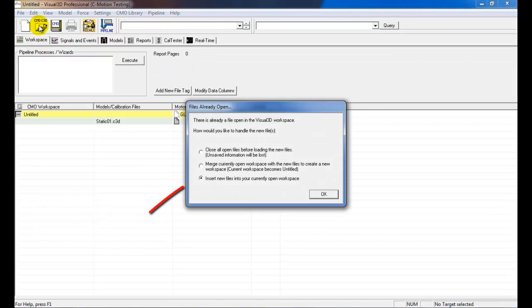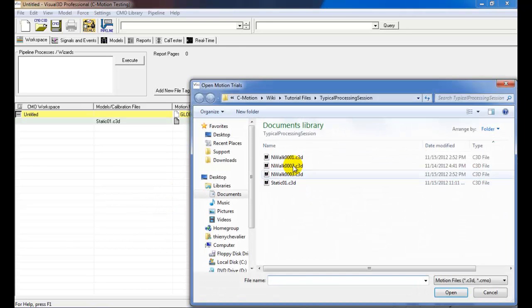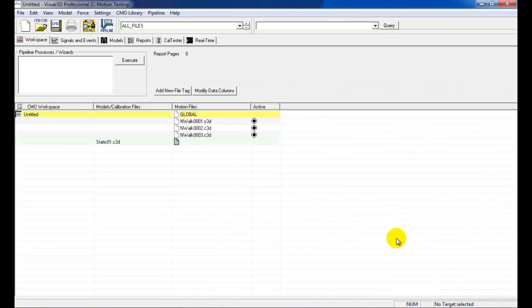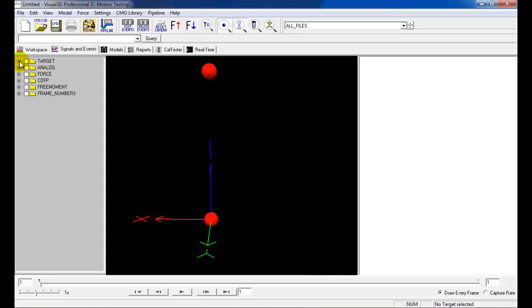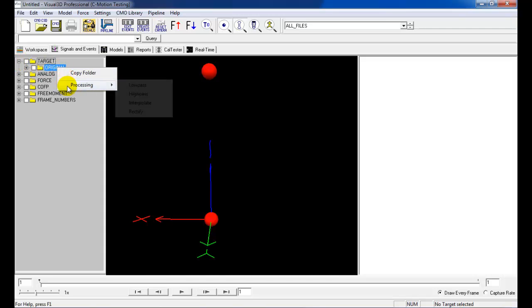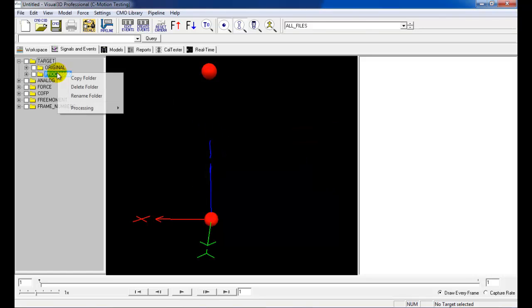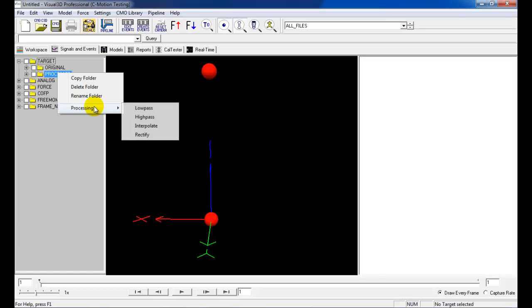Movement trials can now be loaded into the workspace. Select the correct movement files and click Open. Once the files have been loaded into the workspace, simple filtering can be quickly applied to the files. Expand the target folder and right-click on the original subfolder to access the processing options. In this example, interpolation and a low-pass filter is applied to the target signals.